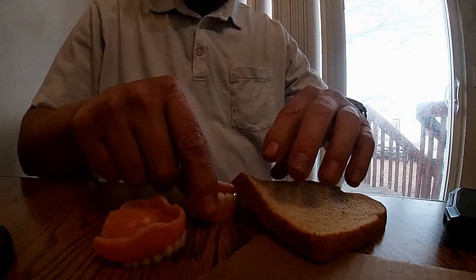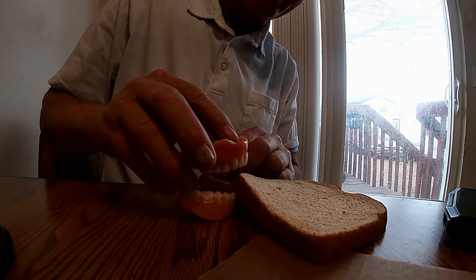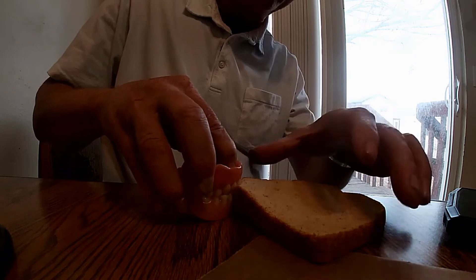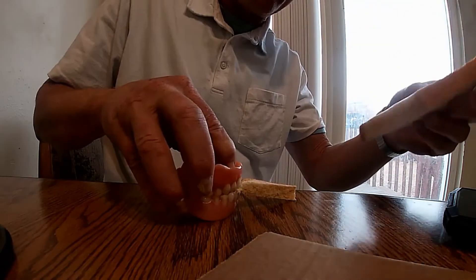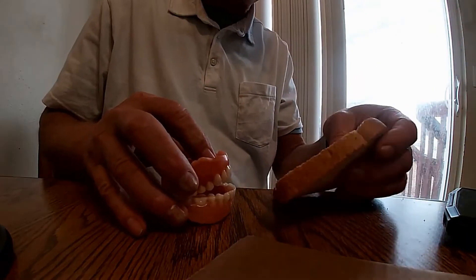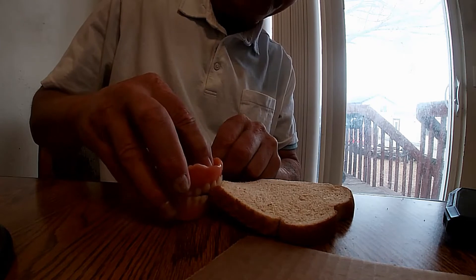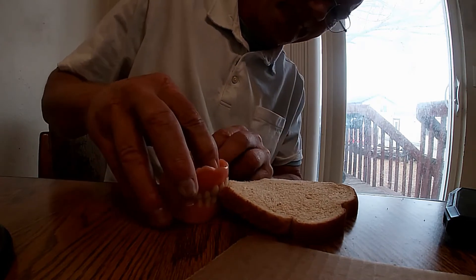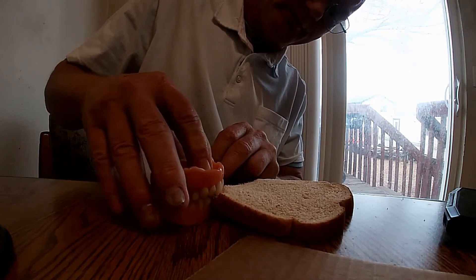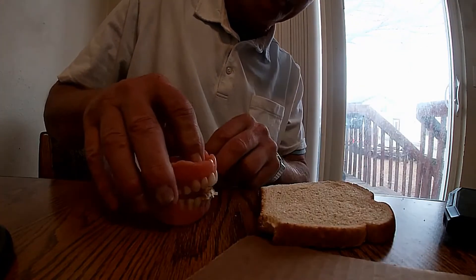So I'm going to put my bottom denture under the bread here just on the corner, and I'm going to show you that if your teeth are lined up straight, all you're doing is smashing the bread — so you have to actually tear it off. Whereas if your teeth are slicing like they're supposed to, see if I can get them lined up here — it's hard to see what I'm doing with the dentures, trying to get them to line up properly. So if you bite properly, as you can see, it slices.